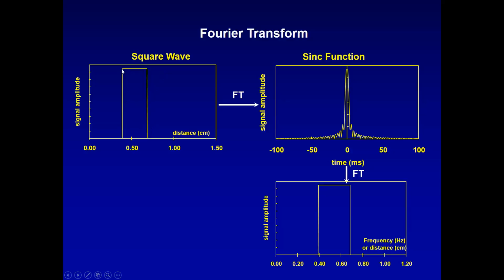Now at the edges, the rise and the fall, there's a lot happening. It's an instantaneous increase from nothing up to full amplitude. And that is achieved in the picture by combining a lot of spatial frequencies, some very high frequencies, because it's not just one frequency jumping up. There's a transition down here from nothing to something. There's a transition from this rise to another flat place, and the same on the other side. So we have a lot of wiggles at this high amplitude information.